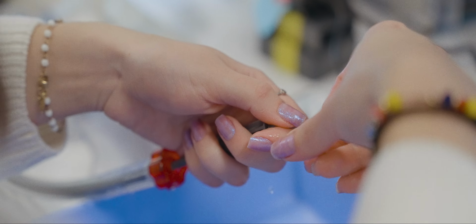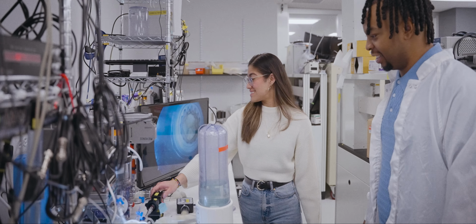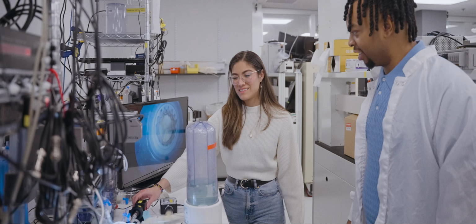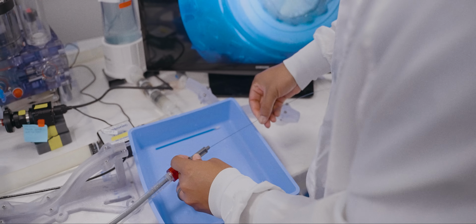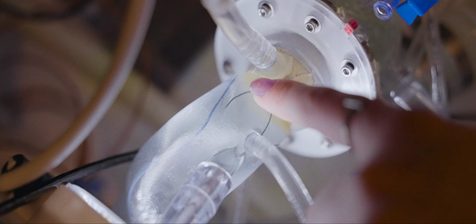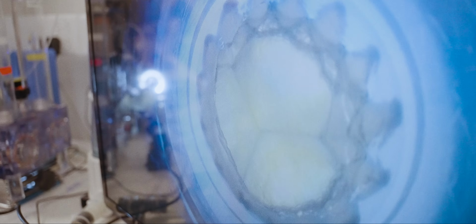What are we about to do right now? Now we're gonna go ahead and load the wire through the valve. This is the live camera feed of the valve that's sitting there. So all you've gotta do is advance this. So just grab it, push. If you look down on this side, you can see that we're out here. And then at some point you're gonna see it on the screen.